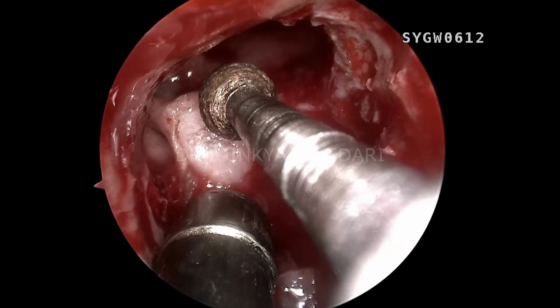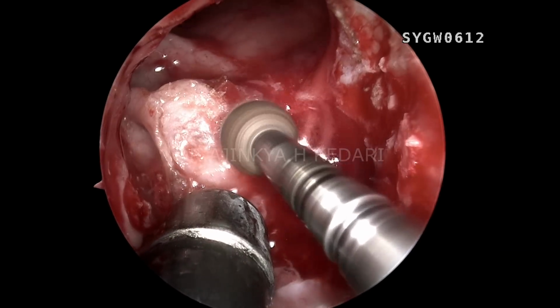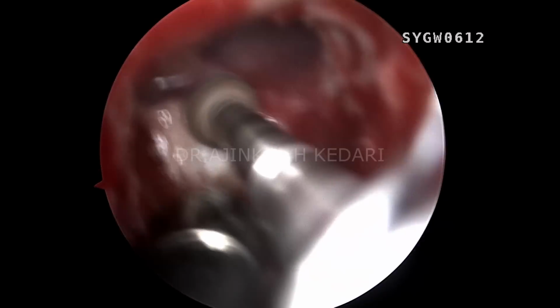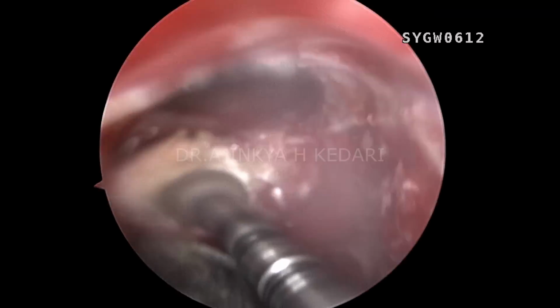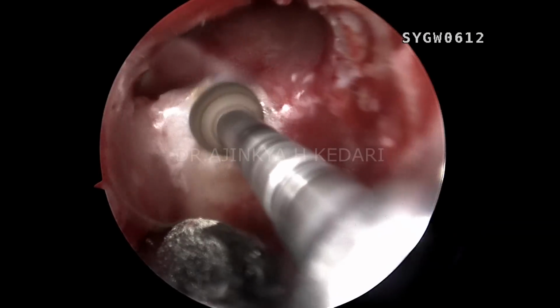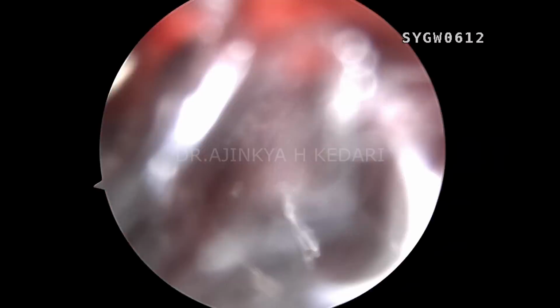What I'm going to do right now is drill that bony projection on the posterior wall of the frontal sinus. Carefully I'm going to drill that, making sure I do not injure the frontal lobe of the brain, because exactly behind this will be the frontal lobe.